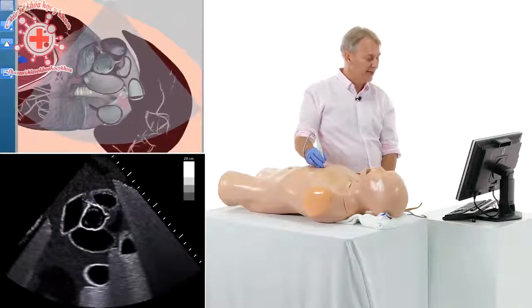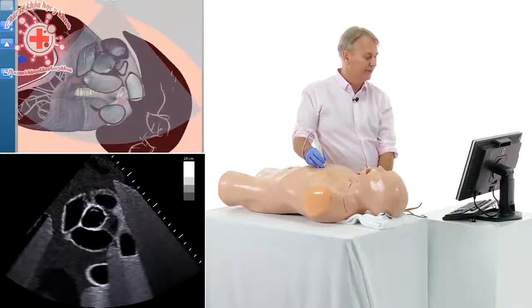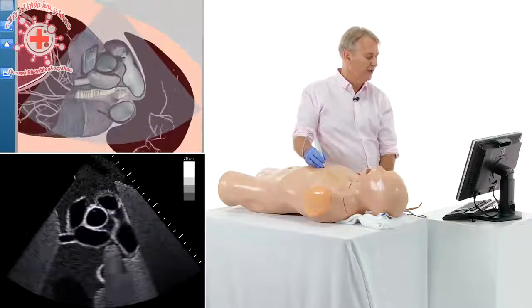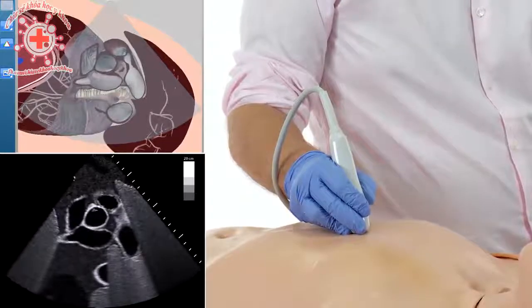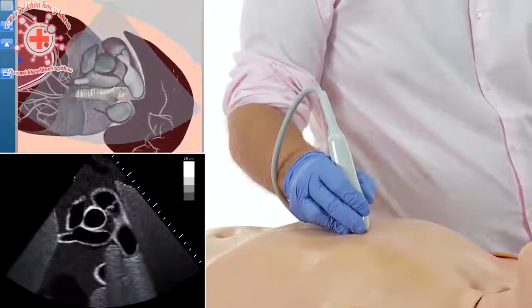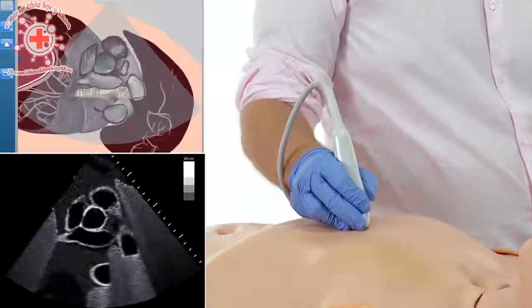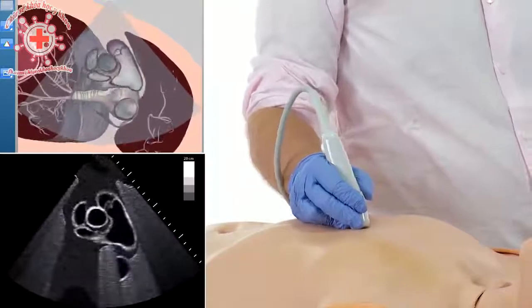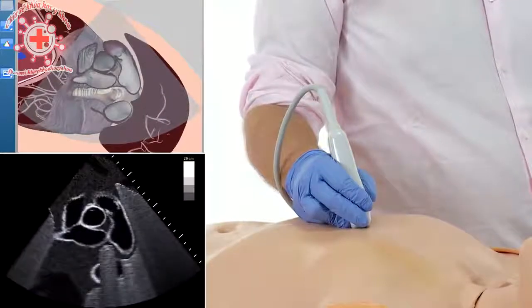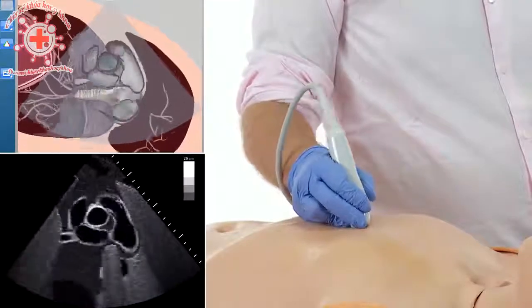What else can you see in a short axis view? Obviously structures you probably already know — the left atrium, the right atrium, the right ventricular outflow tract. But if you tilt a little bit back and forth, you can even see the pulmonary veins as they enter the left atrium. Also be aware that the pulmonary artery is very close by, and very frequently you will already see it in a short axis view. Sometimes you will have to optimize the view — turn a little more to the left shoulder and tilt a bit more — and all of a sudden you will see a very nice long axis view of the pulmonary artery and even the bifurcation between the left and right pulmonary artery.